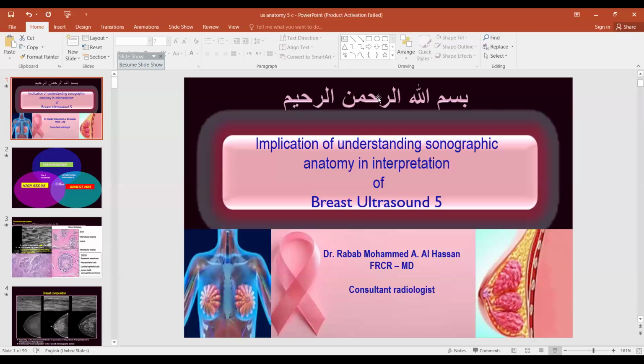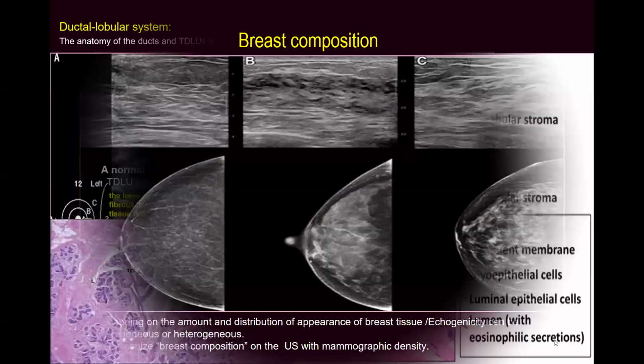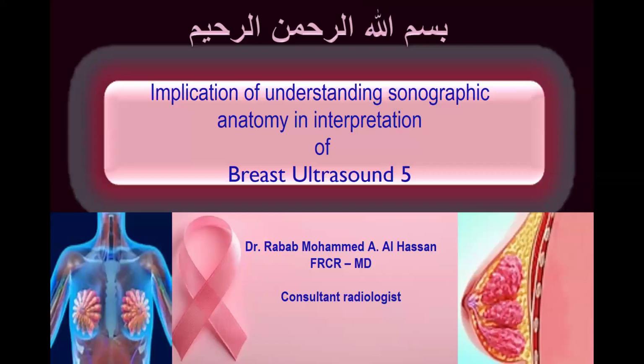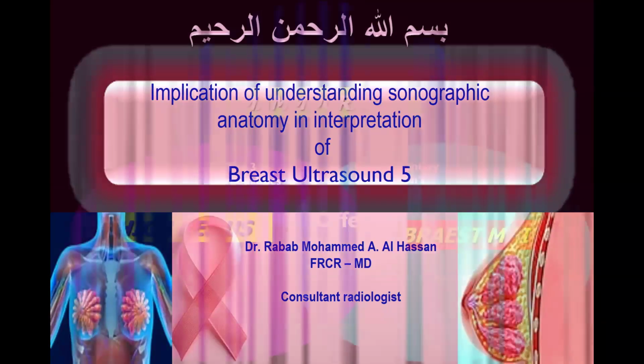And to make it easy, we compare it with histopathology images. If we look at this ultrasound image, here we can see what? Sorry, we cannot see the presentation. Is it not shared? No. Okay. Is it shared now? Yes. Okay, sorry, let us go. Now you can see it? Yes, we can.